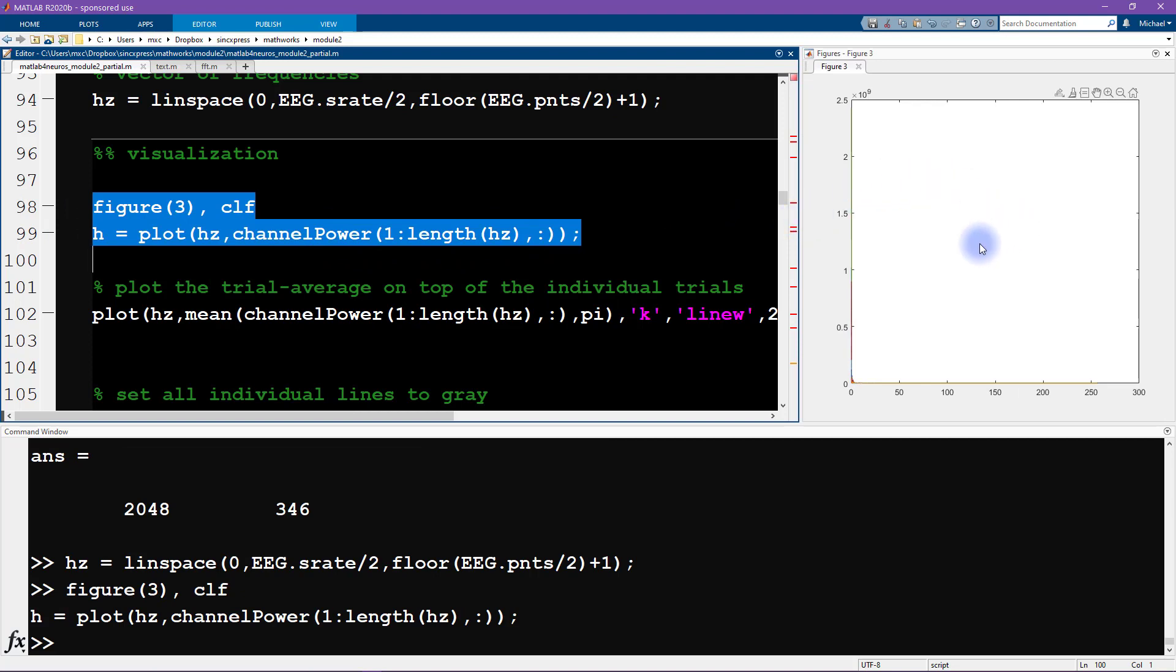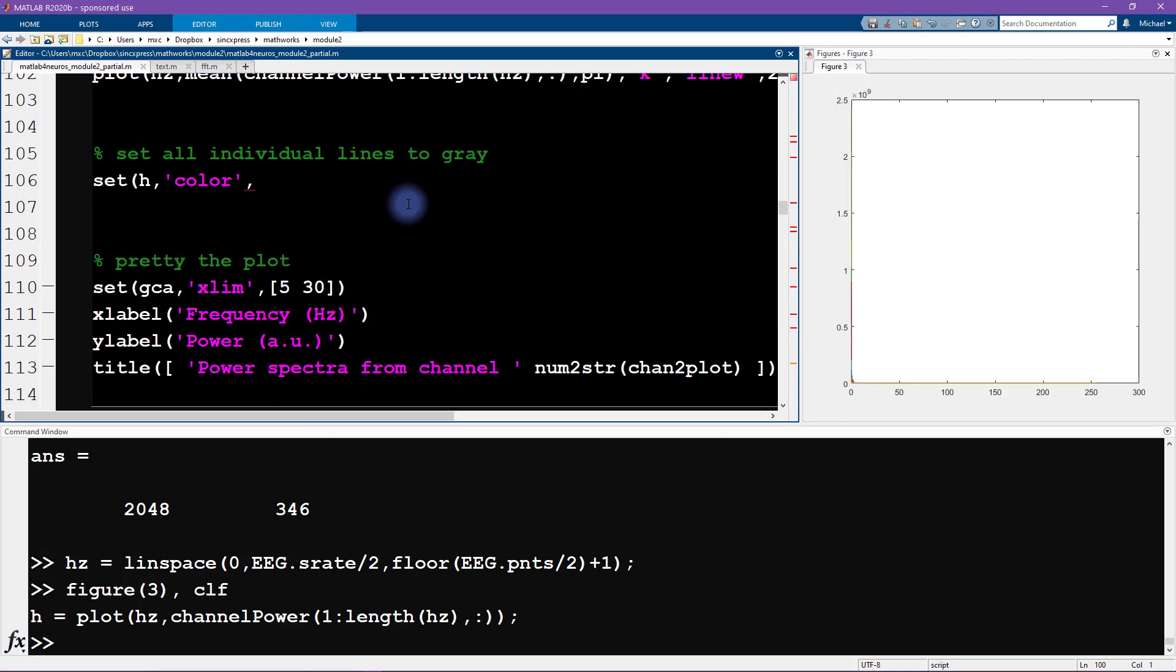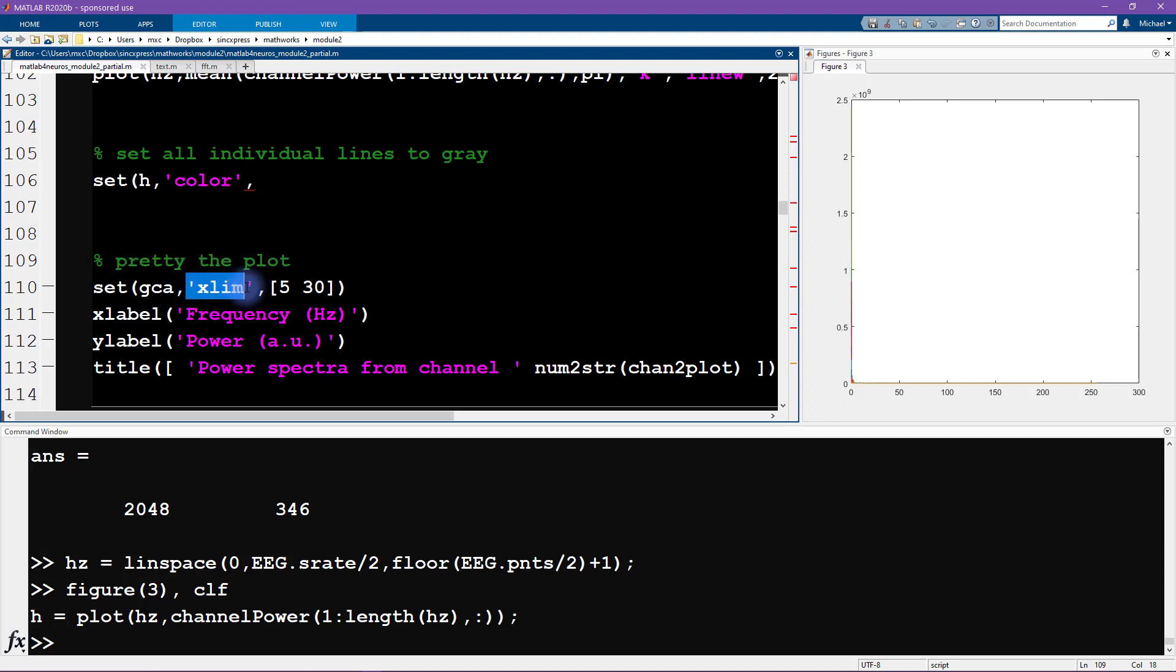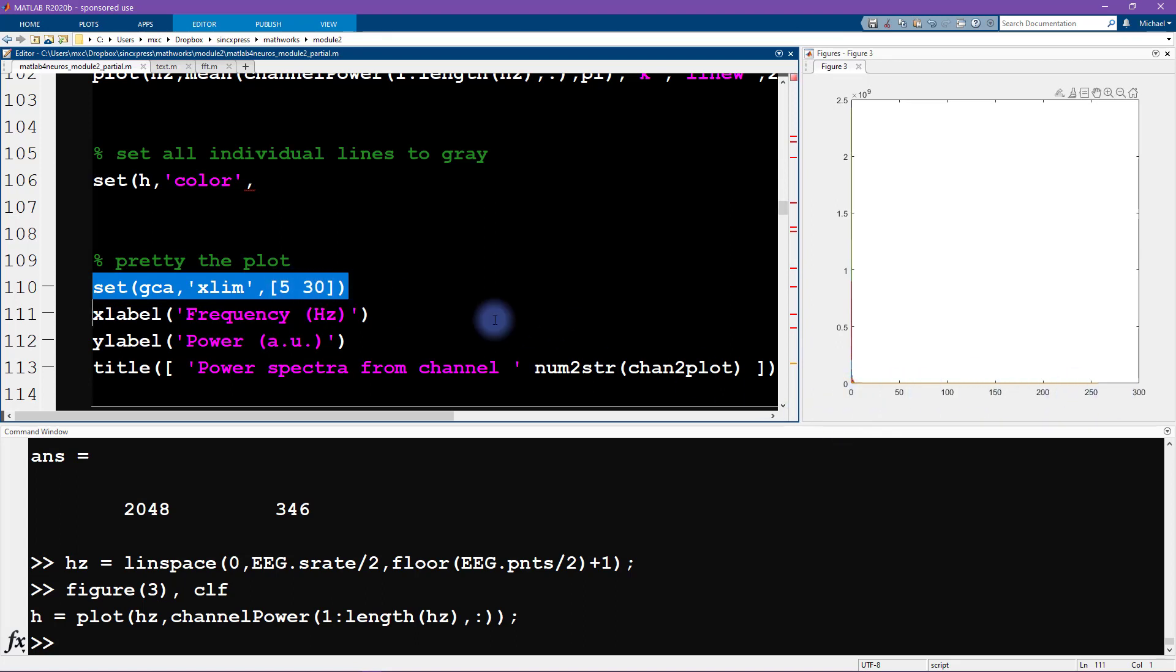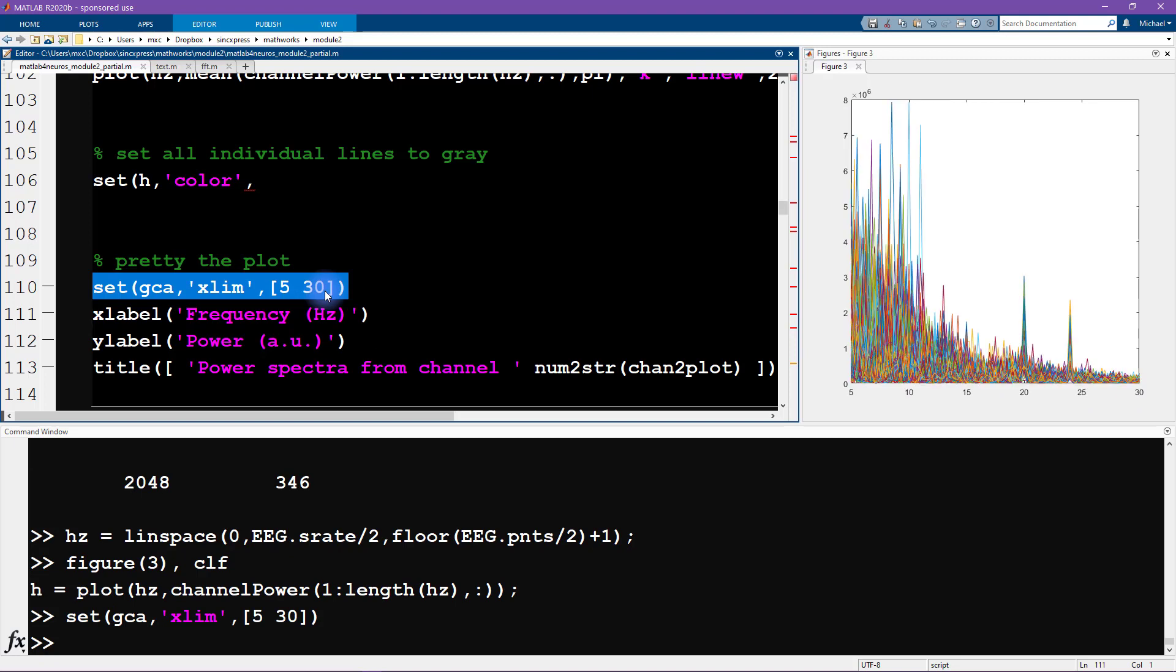Let's run these two lines of code. It looks like two rabbits dancing around in a snowstorm. That's just all white. If you look at the corners here, you can see there's some lines. This is because in this Fourier transform of these data, we have really extreme high energy at very low frequencies. I'm going to restrict the x limit to go from five hertz to 30 hertz. That just zooms in on the plot.